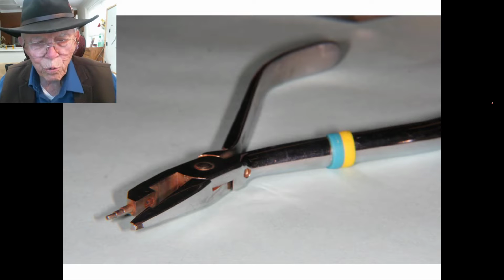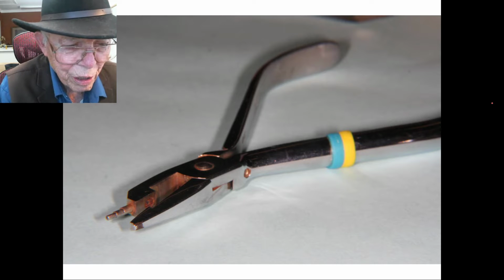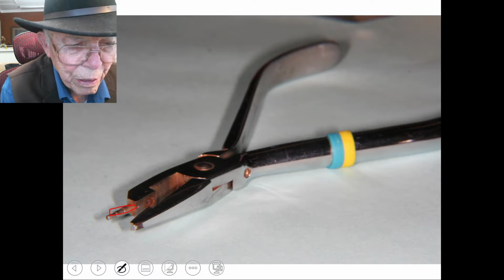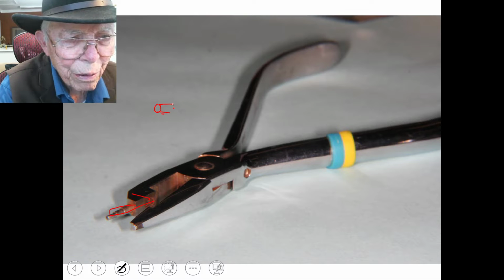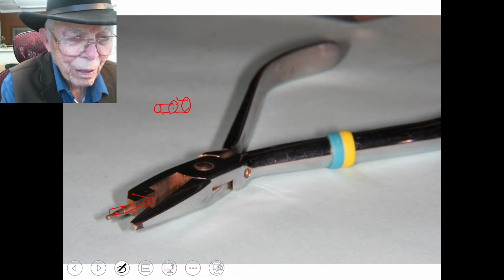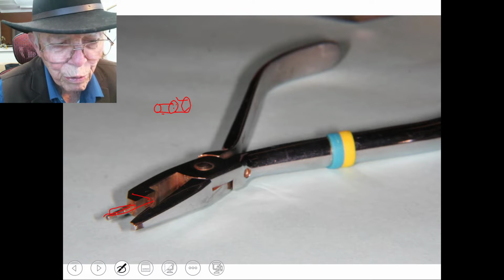This is the tweed loop forming plier, and you can see it's got a little steel piece that comes out here, goes in, and has a lock screw that screws it down. This has 3 different sizes to it. It goes over here, and it'll have another bigger loop, and then it'll go over and have another loop bigger than that. And this little piece of projecting steel here has these 3 loops on it.